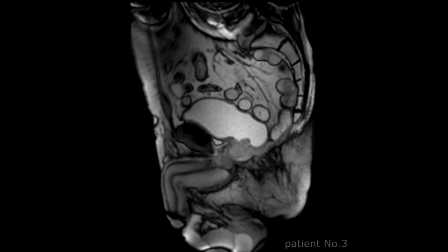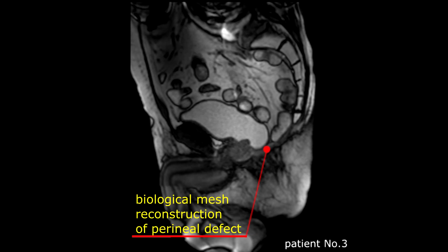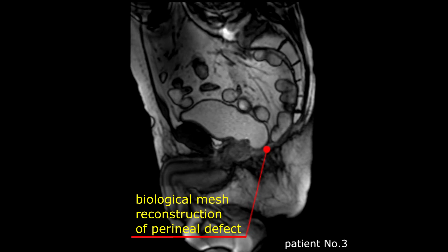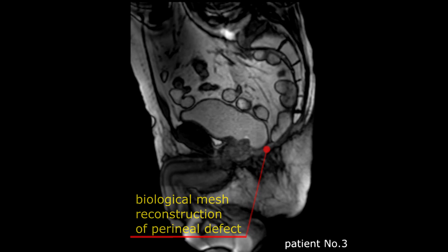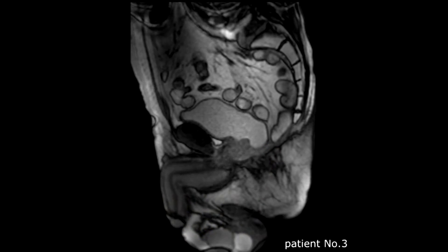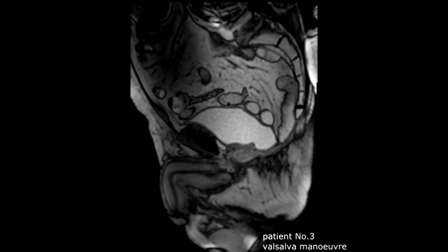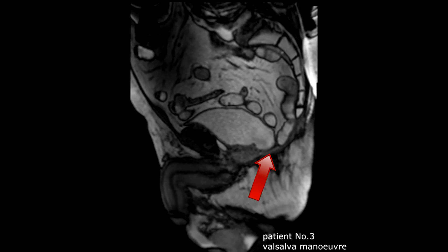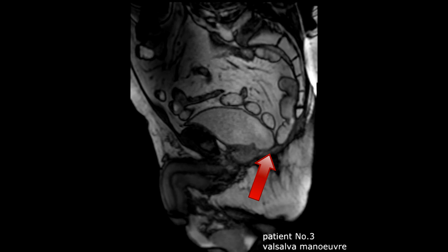These dynamic MRI views are recorded at rest. Once again, a red coloured pointer points to the reconstructed pelvic floor. During a Valsalva manoeuvre, no significant movement of the pelvic floor plate is noticed.